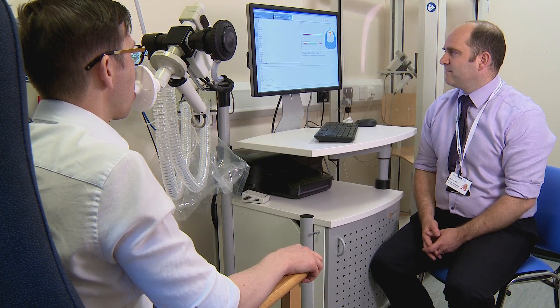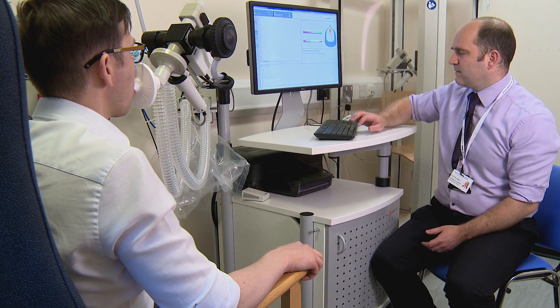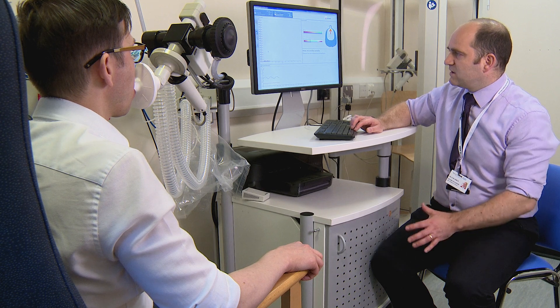If you'd like to pop your mouth onto the tube for me, please. Lips tight. Neck and shoulders relaxed. Just breathe in gently in and out, nice and easy. That's good. When you feel you're ready, just a nice breath in.